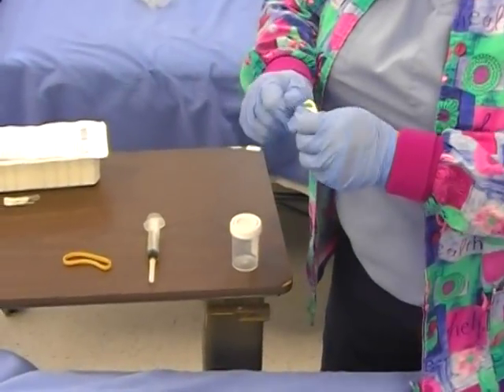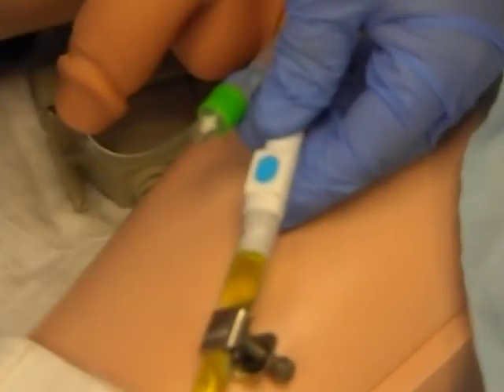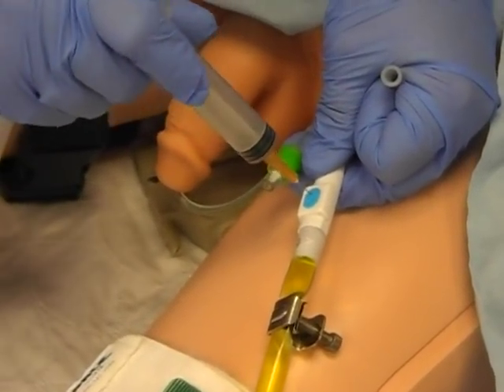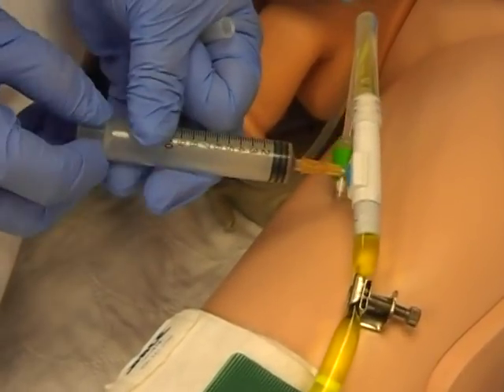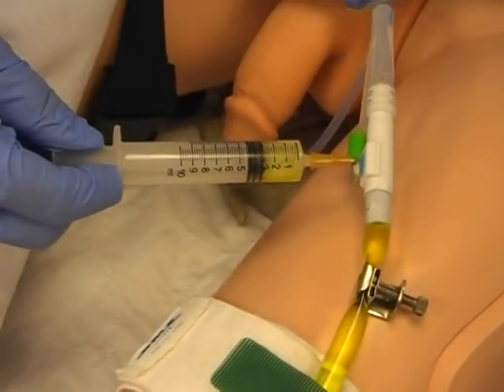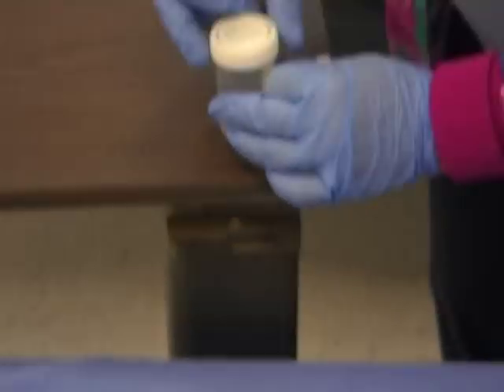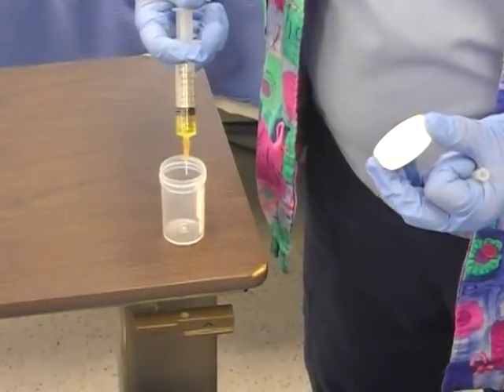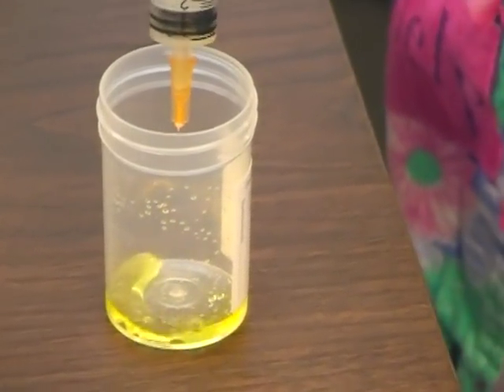Because this is a needle system, I'm going to take my alcohol and clean my extraction port really well. Then I'm going to take my needle and stick it into this port — the needle goes right in; it's made to do that. It's impermeable. Then you just draw back the urine. The needle is really small, so it's going to be a little hard. Draw back and collect all the urine that was in the tubing. Then put it into your specimen cup. Don't put the needle down on the table because now you've just introduced microbes. You're not going to get a whole lot here — it's just what was in the catheter itself.